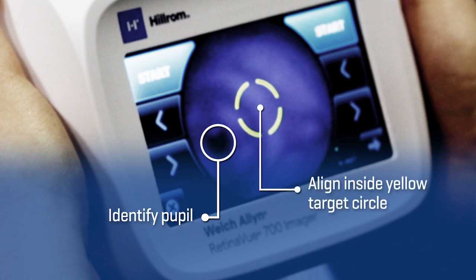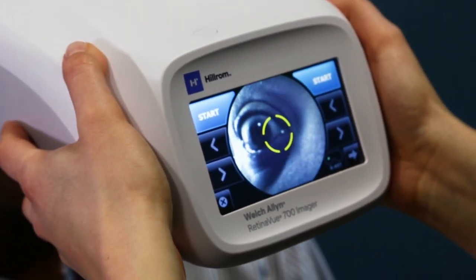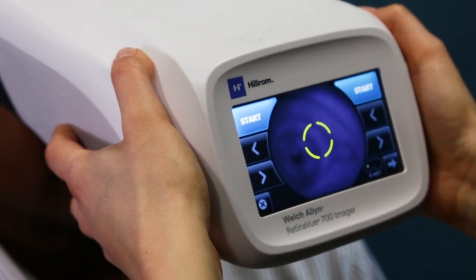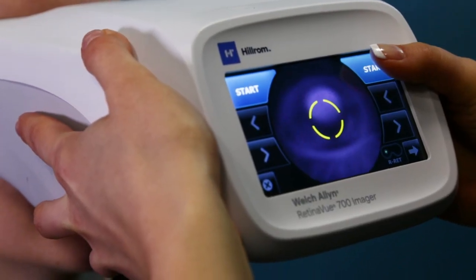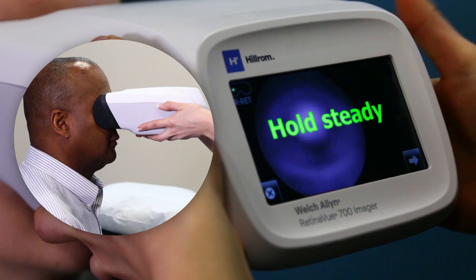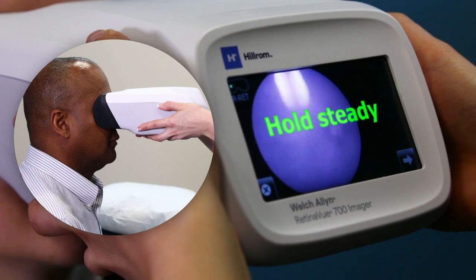If the pupil is located above or below the yellow circle, pull the imager slightly away from the patient and realign the pupil to the yellow circle. The patient will see green and yellow dots in the shape of a plus sign. Confirm the patient can see the entire plus sign and tell the patient the plus sign will transition into a green dot. Ask the patient to follow the green dot. Use your thumb to touch Start and hold the imager steady while keeping it pressed securely on the patient's face.